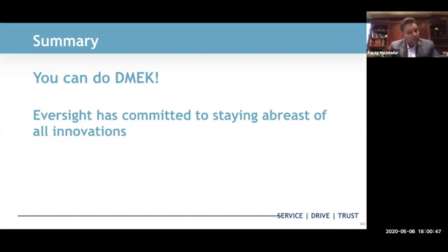Now, the only caveat there is if you can't visualize the phaco part of it. So if somebody comes in with a really edematous cornea, then sometimes you might have to do DMEK alone first and then do phaco. I've certainly done that in younger phakic patients who have bad Fuchs dystrophy. I've done the DMEK first, and then some have had cataract surgery 6 months, a year, 2 years later, whenever they need it. There is a slight potential for the graft to be affected, but most patients do very well.